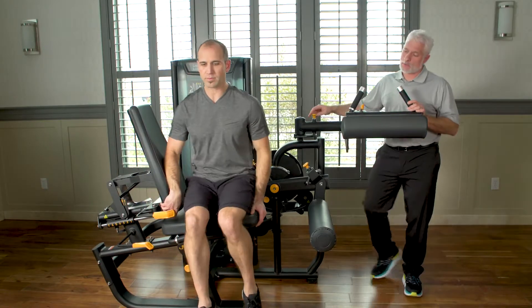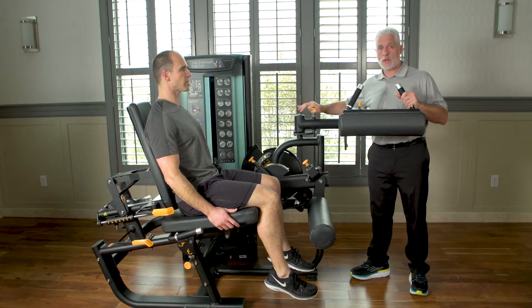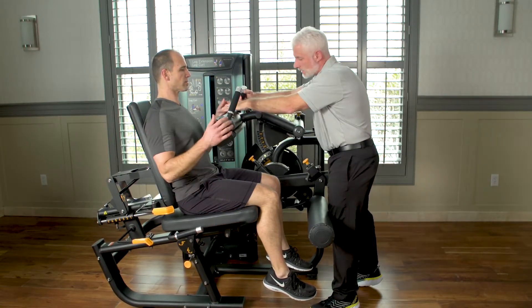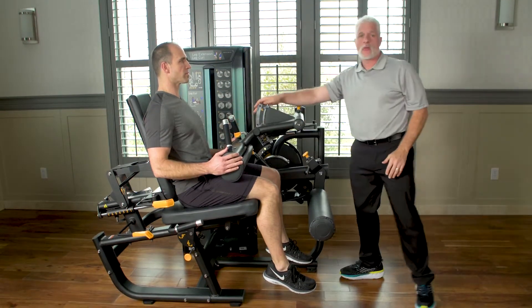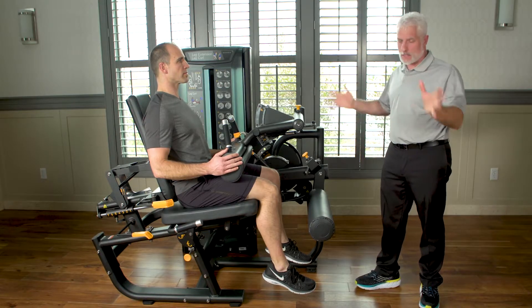As Garrett comes around, he swings his legs around the front, and as he does that, this little lever — you just pull it up, slide it over — locks right in. It has good stability. This moves here and lowers down on the thighs, so you have good stability and easy entrance for any patient population.